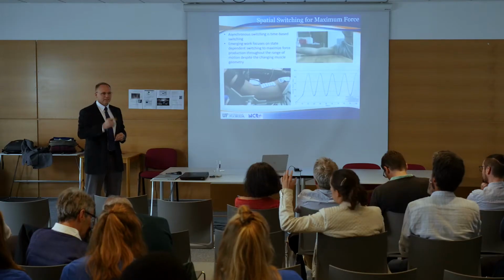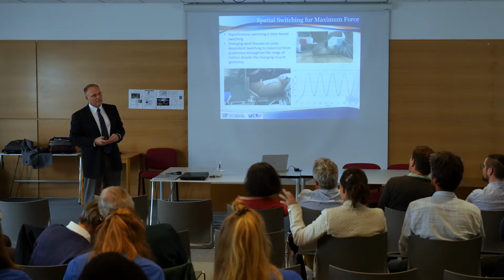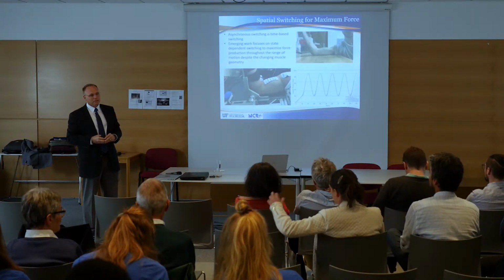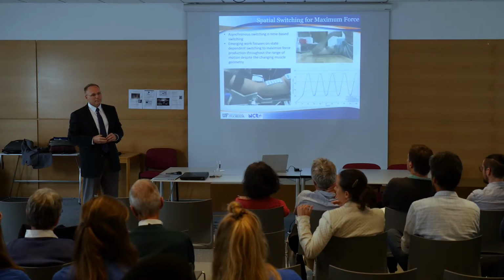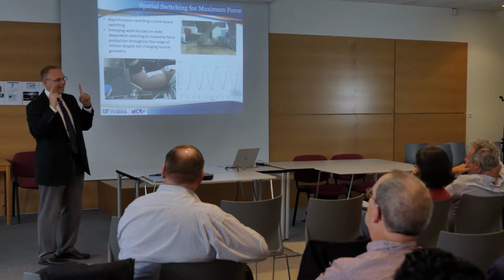Do you remember if the intensity of 4 channels was the same as the intensity on 1 channel, in the case of conventional and asynchronous? Yes, the intensity was exactly the same. The only thing that was different was the duty cycle per channel. Because the first time we did a study in 2009, we did a similar distribution of electrode positions. In order to get the same torque, we needed to reduce intensity to 75%. So if it was 1 channel, it was 100%, and with 4 channels each was 75% to reach the same moment. Since it's normalized, I don't have the exact data.